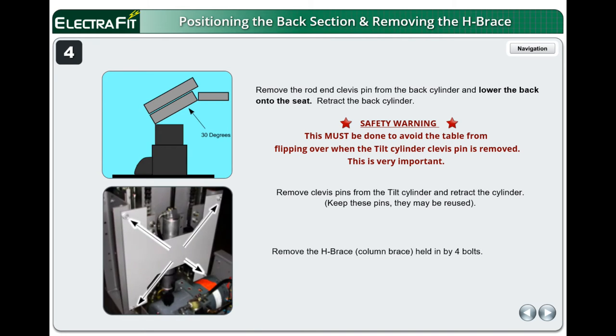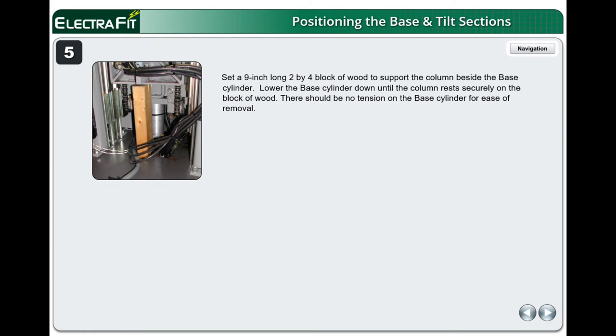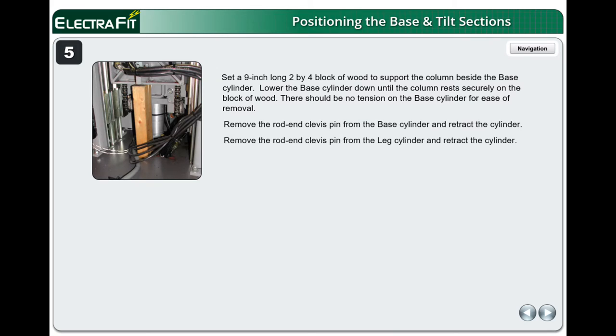Remove the H-brace, also called a column brace, held in by four bolts. Set a 9-inch long 2x4 block of wood to support the column beside the base cylinder. Lower the base cylinder down until the column rests securely on the block of wood. There should be no tension on the base cylinder for ease of removal. Remove the rod end clevis pin from the base cylinder and retract the cylinder.